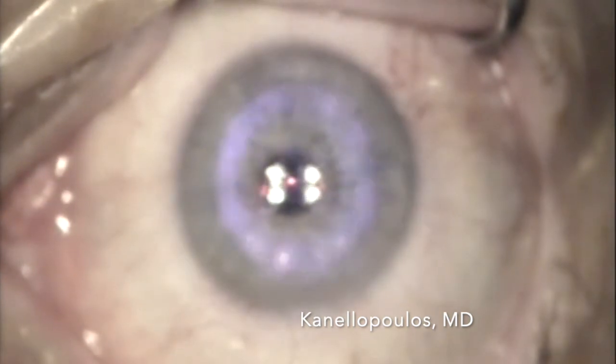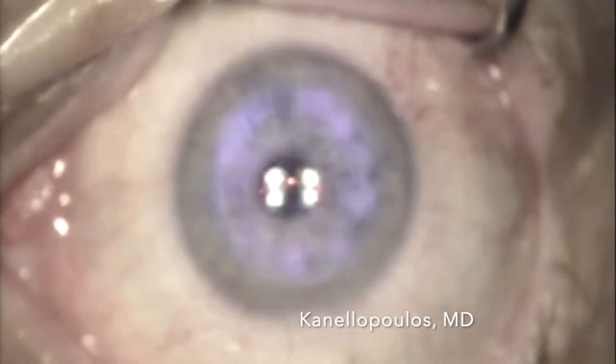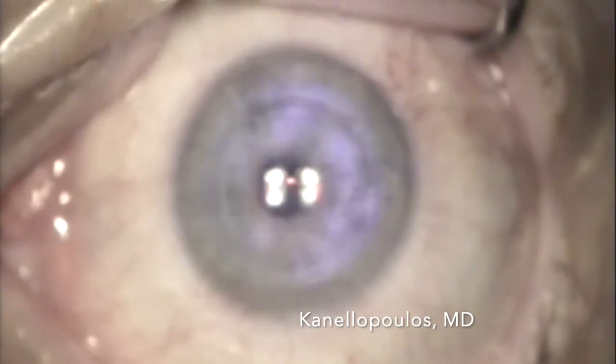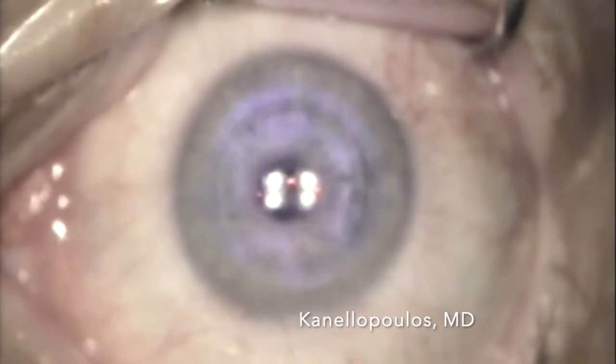We're engaging the laser. This is a straight hyperopic correction, no cylinder, so centration is not as important. You can see here we're sculpting through the epithelium, making this a trans-epithelial treatment. This is real-time. You can see we're past Bowman's, so now the actual refractive effect in the stroma takes place.